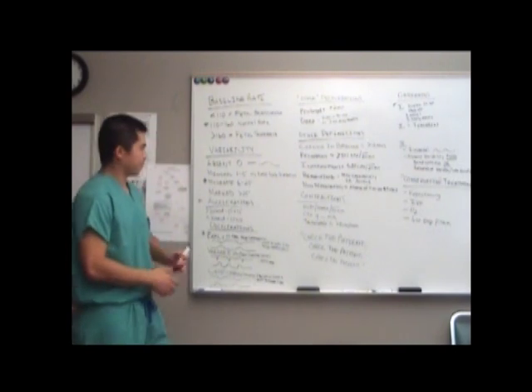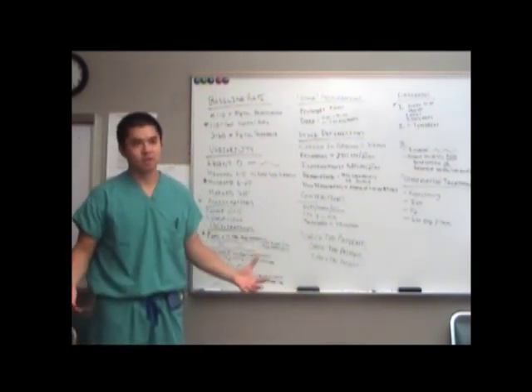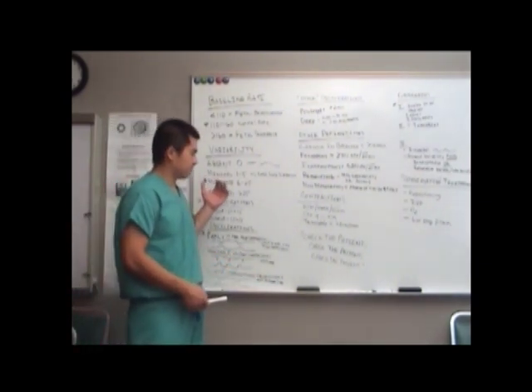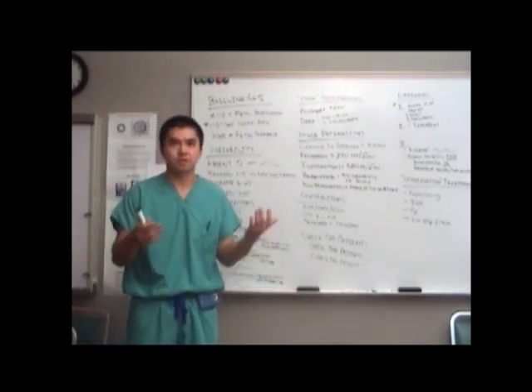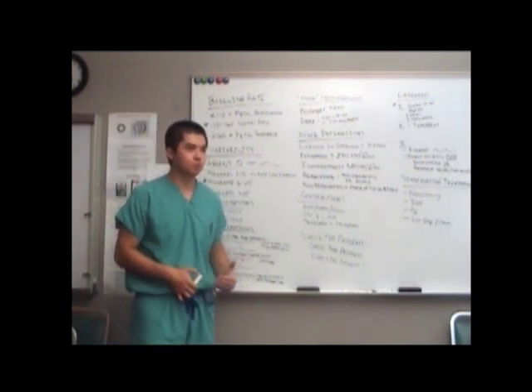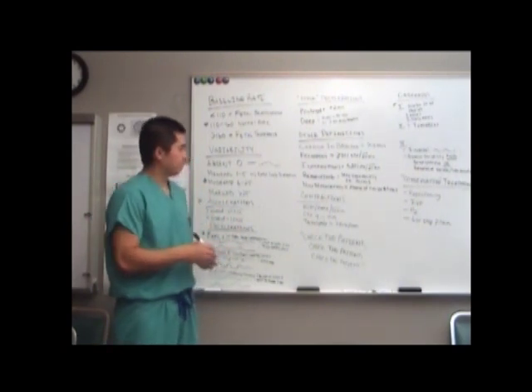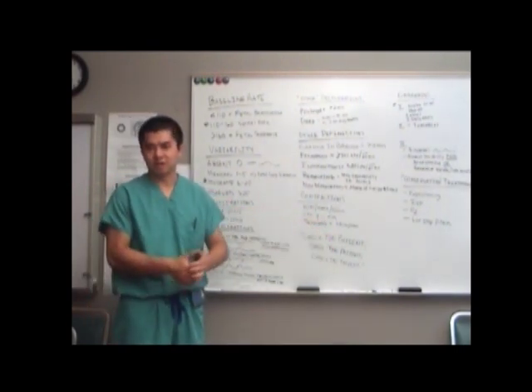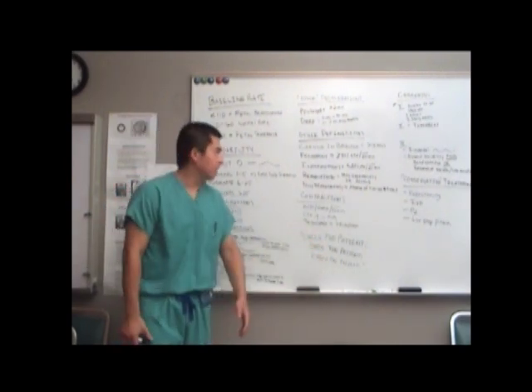So often, the baby is trying to communicate with you that there are things changing in its environment. And so often a big decel might be an indication that the mom's just dilated really quickly from a 6 to complete. So always check the patient, even if you just did it 1 minute ago. Because who's to say that all moms dilate gradually over the span of 4 hours rather than at a single point, and you don't see that just because you're only checking them every 1 to 2 hours.